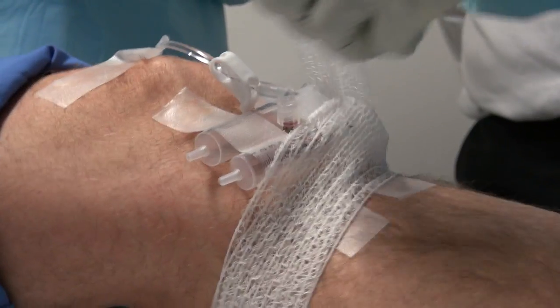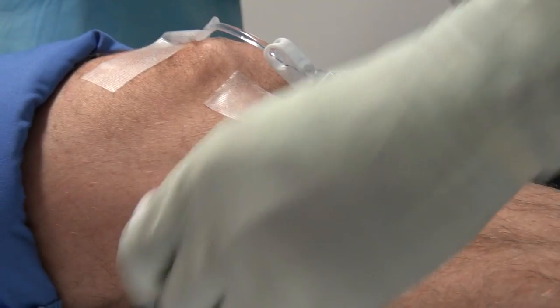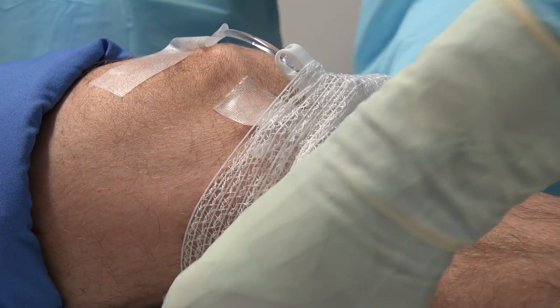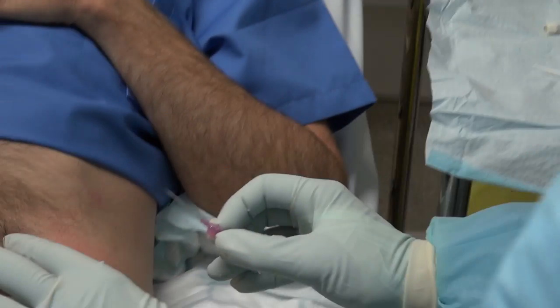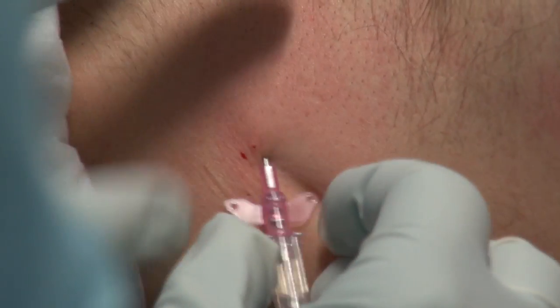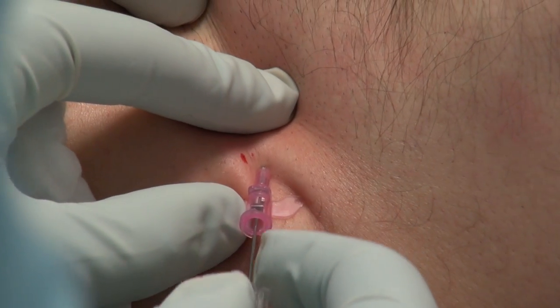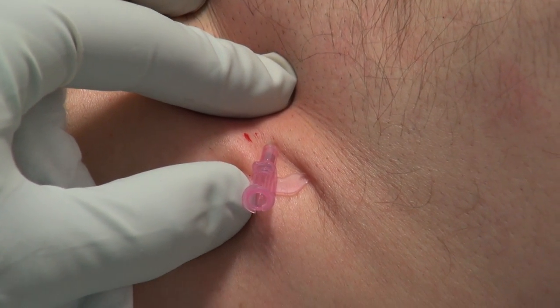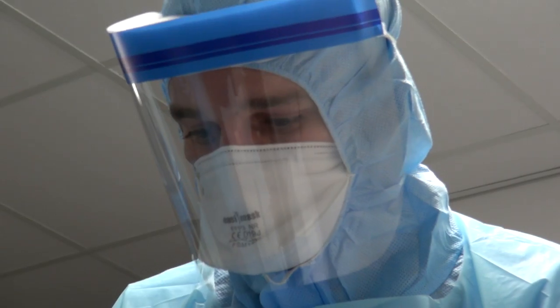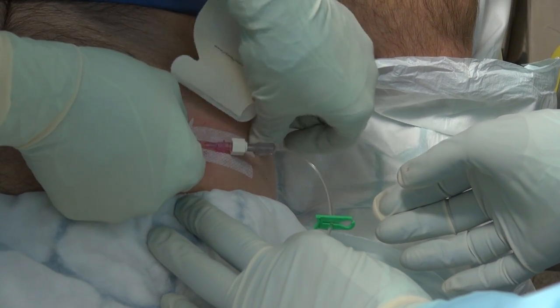lines may be preferable. On the other hand, some patients might not be severely dehydrated, but are at risk of dehydration because they're not drinking enough to keep up with their fluid losses. In these patients, the subcutaneous route is a quick and easy way to provide maintenance fluids. Subcutaneous infusions are often used to keep patients hydrated in community settings. However, they might also have a role in the management of patients with Ebola virus disease.